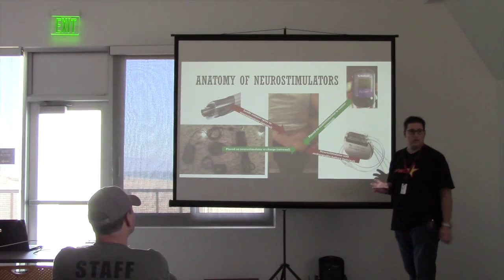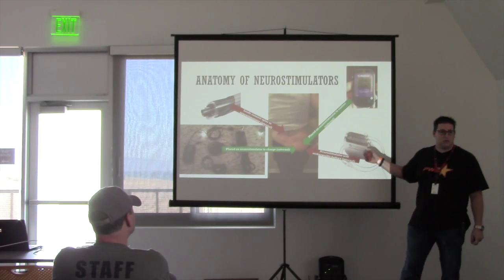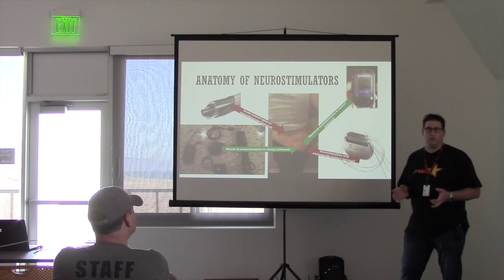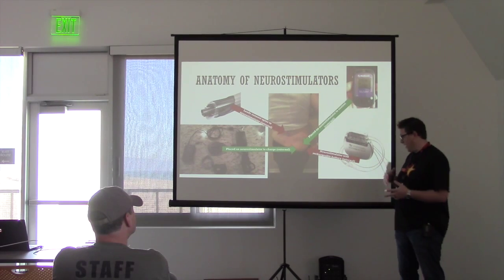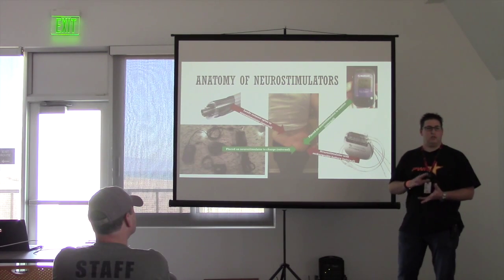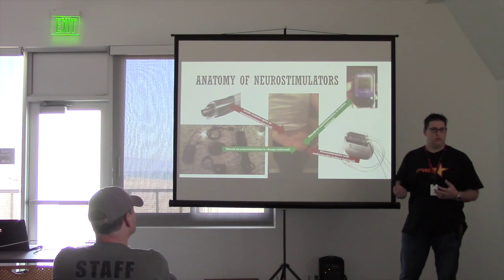What's the expected lifespan of that device? This particular device is up to 9 years. And that was one of the considerations when I did the threat model: there's 3 major manufacturers. Some of them only have a 1-year or 2-year lifespan. And I wasn't willing to have that kind of surgery on a regular basis, if you think of the scar tissue that forms. So prognosis-wise, with CRPS, they hope it burns itself out by the electricity essentially tricking the nervous system into resetting eventually. So with a 9-year span, we're hoping eventually it'll reset itself.